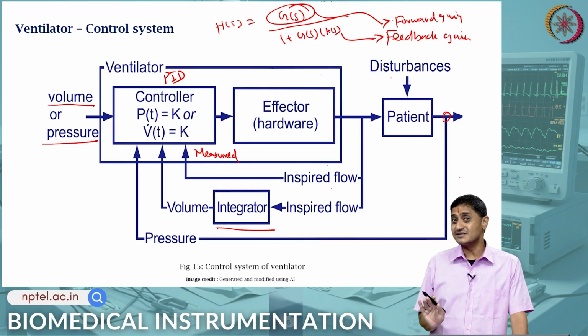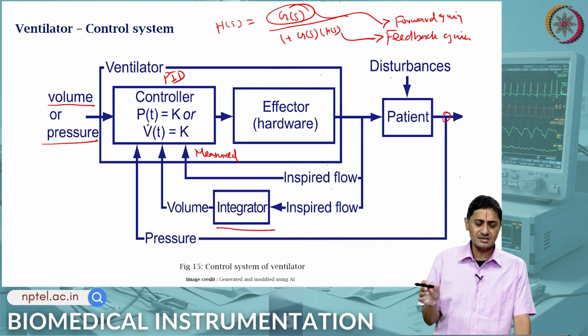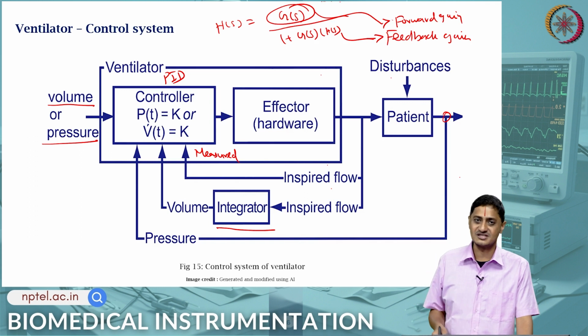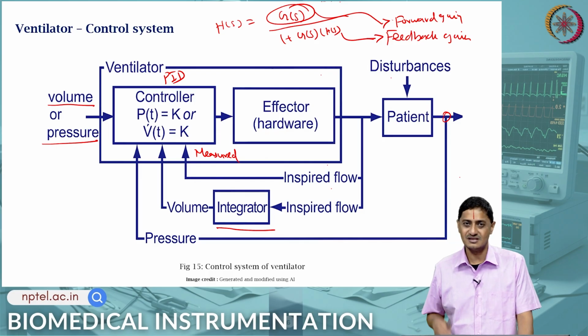But depending on whether the terrain is hilly, uphill or downhill, the power and speed relationship, likewise the volume and pressure relationship in the lung, may change depending on what type of disease the patient is having. So power is not equal to speed in uphill or downhill slopes, as in cruise control, for example.